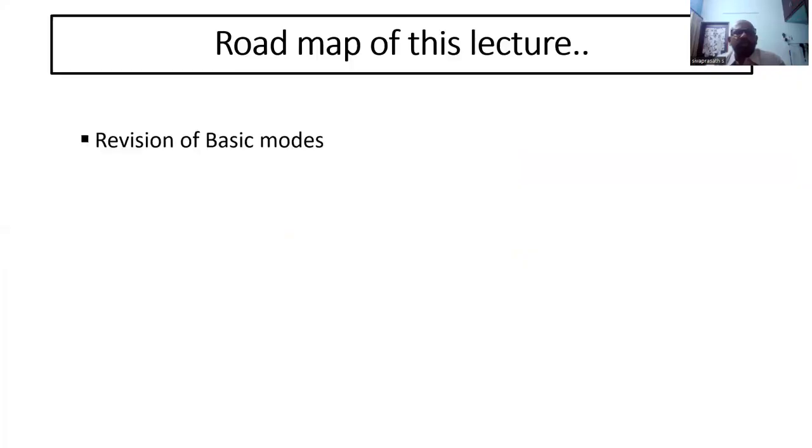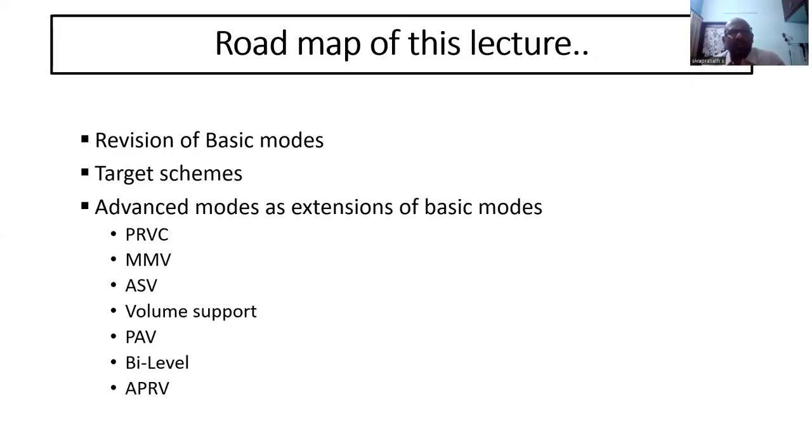So in this lecture, I'm going to revise some of the basic modes and how they work. Though you have to look into the previous lecture, I'll just go through it in a quick sequence, and I'll also teach you what target schemes mean, and I will teach you all the advanced modes as an extension of all the basic modes. See, more than 500 to 600 modes are there clinically now on ventilators. But if you know how to classify them as an extension of a basic mode, it's easy for you to understand and to apply whenever you need it.